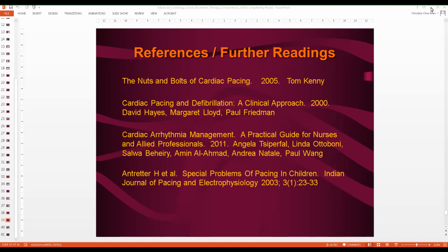So now on some of these, and again, it would be good to talk with the CVS team about it. On some of the very small infants, they have done some intrathoracic implants. So the device is actually located inside the rib cavity, the chest cavity. And I do have a couple of patients like that that we just have to watch very closely. They're certainly very, very challenging. There are risks for every complication that can happen, right? Erosion, infection.